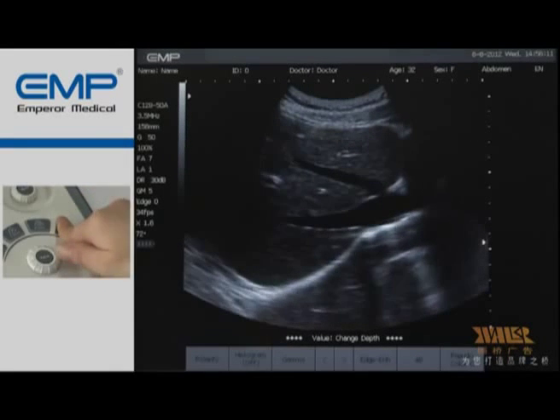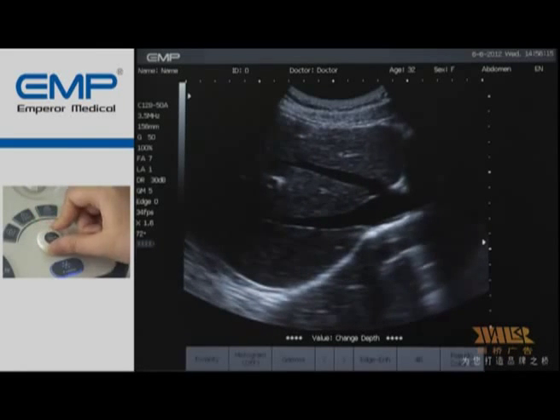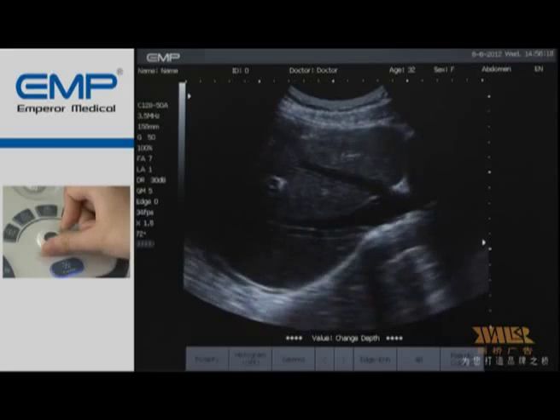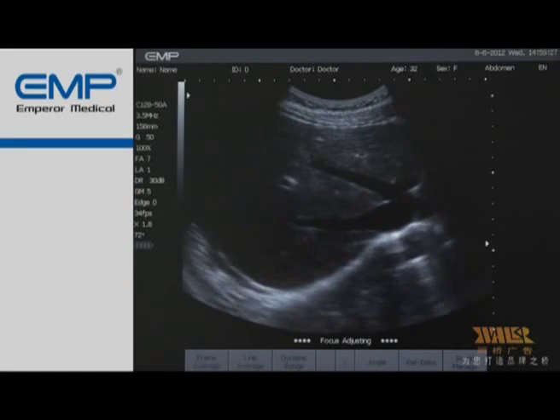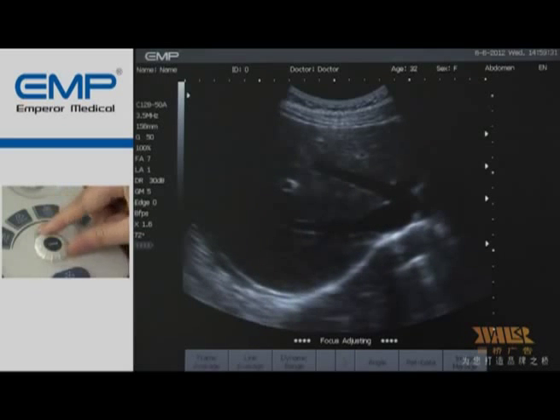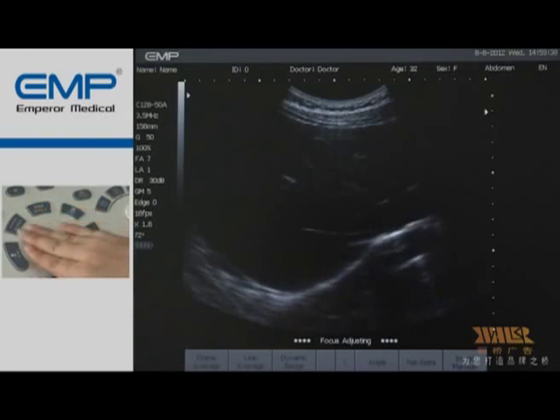Press the Depth button and turn the value knob to adjust the depth. Press the Undo button to quit the adjusting process. Press the Focus button to enter the focus adjust process. Turn the value knob to increase or decrease the number of focuses. Use the trackball to select the position of each focus.